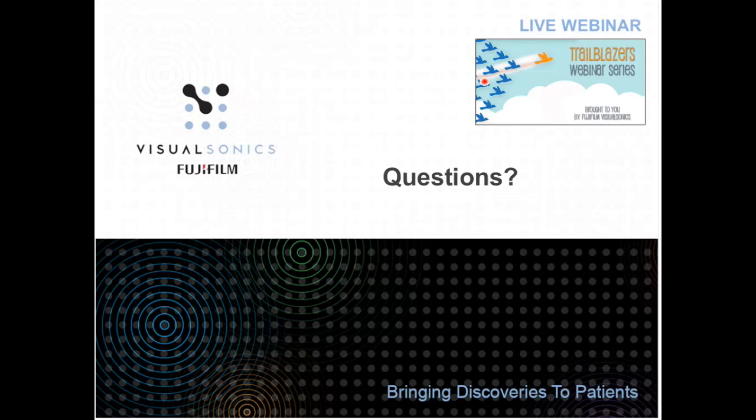Just from an overall perspective, I've done a lot of this imaging, and I would consider the changes in the spectra due to the changes in the contrast agent a much more significant factor than the change in the fluence. So what I'm talking about here: we send light into the tissue, it hits the surface of the skin, it scatters, it goes everywhere. So we're hoping to get a more uniform fluence because of that delivery of the light. But also the changes of the agent.